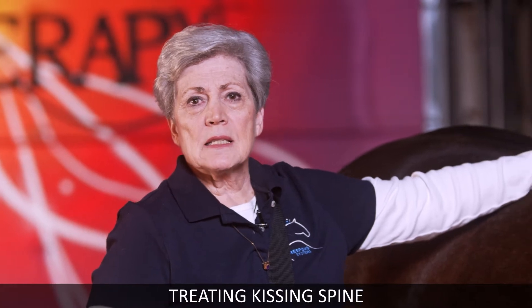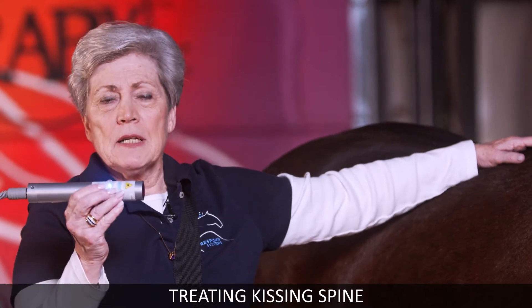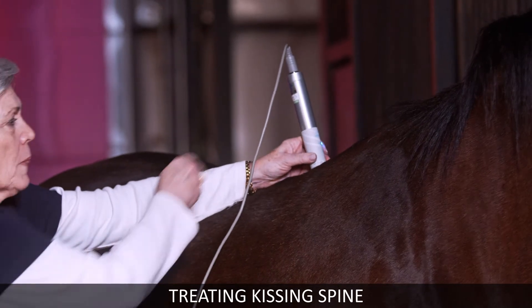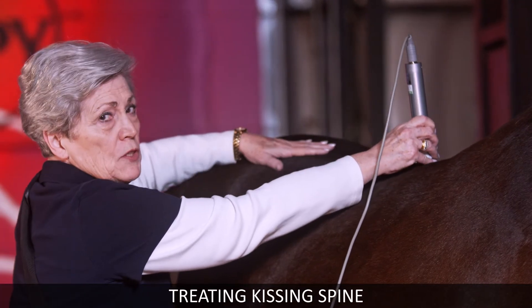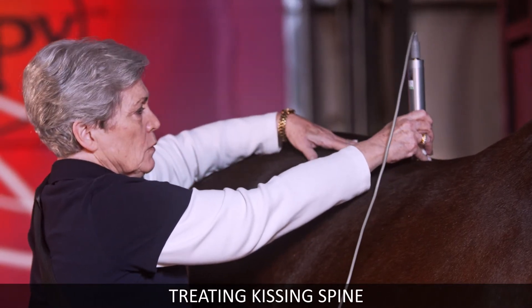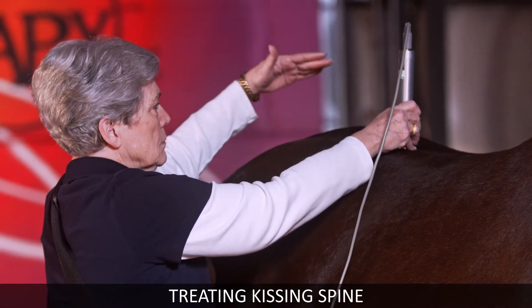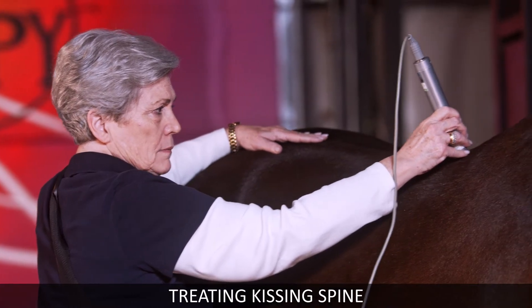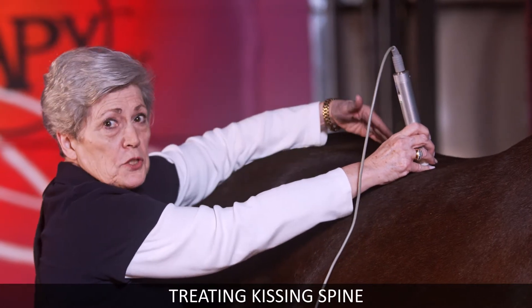The first thing I want to talk about is treating kissing spine. You will use the cylinder head. It beeps every two seconds, and you will leave it in each spot for just two beeps. Go down the spine, and then when you come back, go down each side of the spine. Then do the same thing on the other side also.